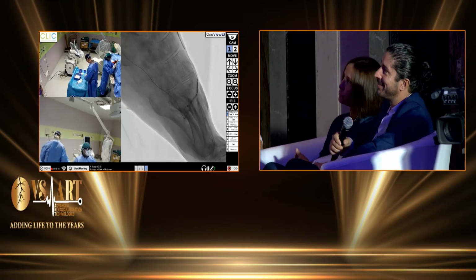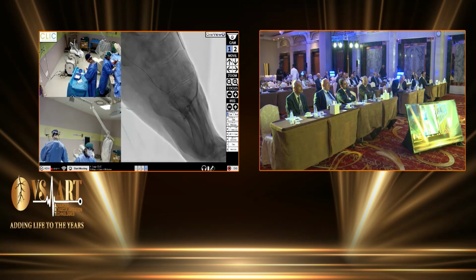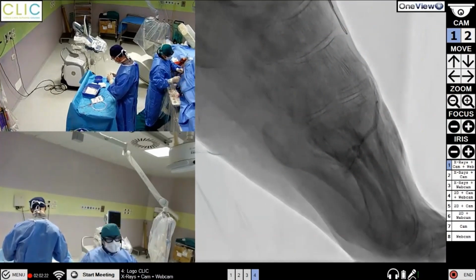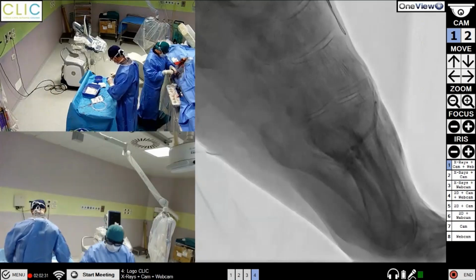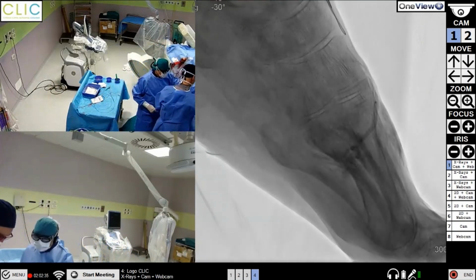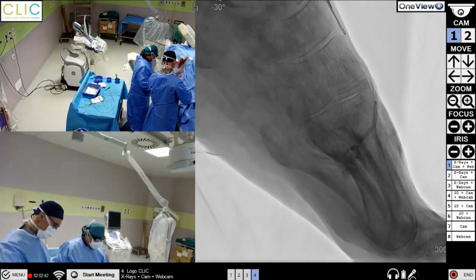I'm close to close the session too, but these last 2 centimeters are really tough. I will do my best. I'm going to change my wire. We asked for another 5 minutes and we succeeded, so you have another 5 minutes to delay us. I'm trying to change the wire. I asked for an Astato 20, so we are at the end.